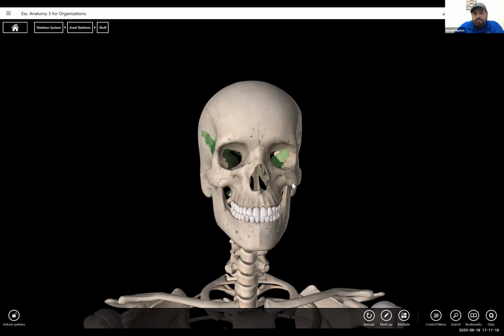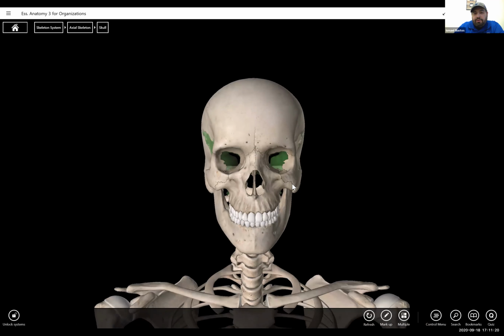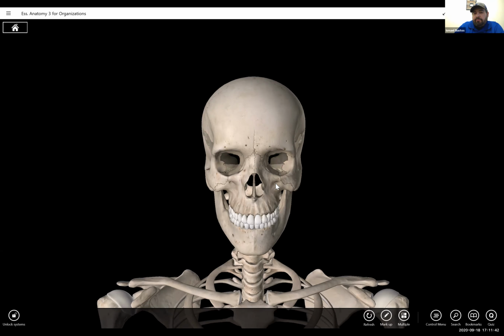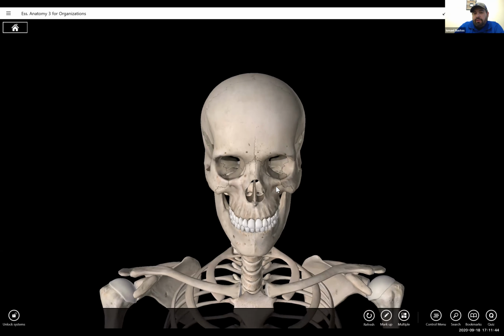So if I'm here, and you're the image receptor, right? So you're looking at the image receptor. You're the image receptor, there you go. You see the petrous pyramids in the lower 1/3 of the orbit. Now, what happens if you start seeing the petrous ridges move within the orbit? How would I get those petrous ridges to move further into the orbit?